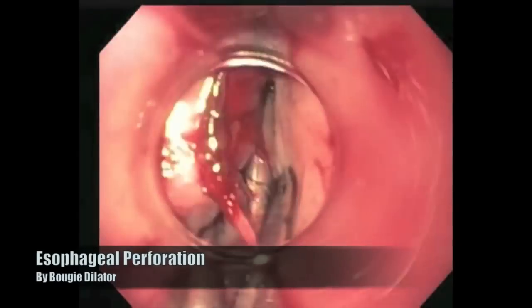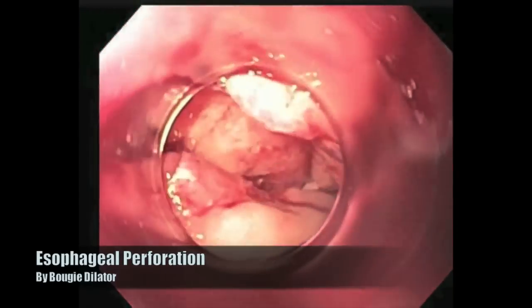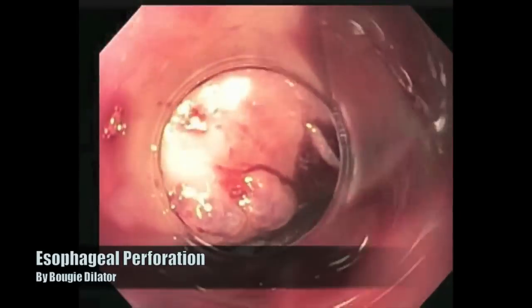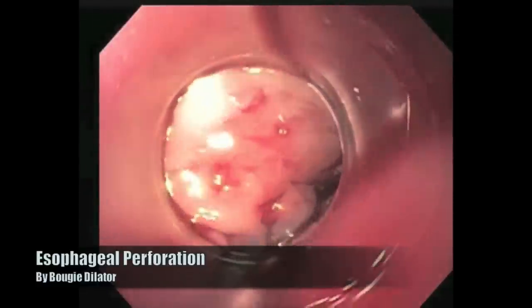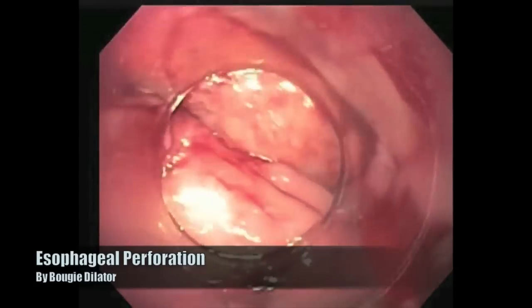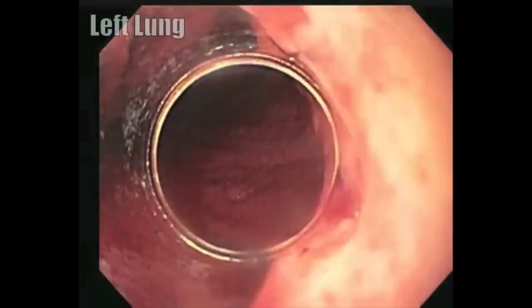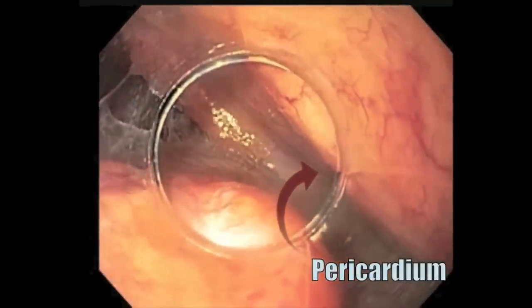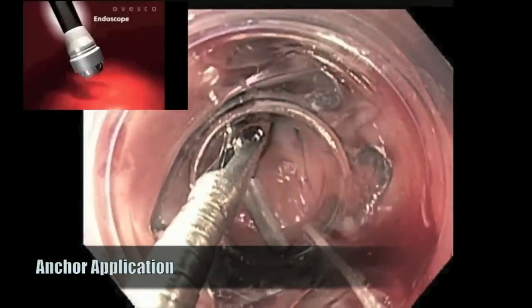One can see an endoclip that represents a previous attempt at closure of this fairly large esophageal perforation. Using the endoscope, one can have a view of the left chest and the mediastinal structures. A thoracic lavage was performed with suctioning of the purulent fluid. Given the size of the perforation, a double-armed grasper is used.